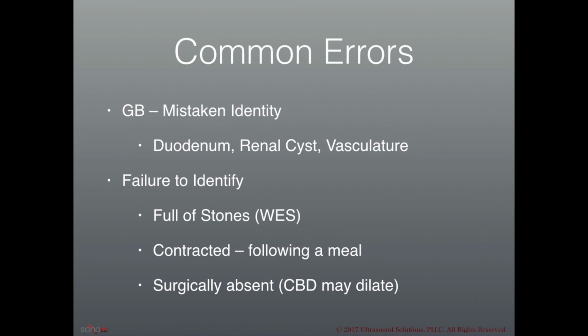You also may be unable to identify the gallbladder if it's full of stones, so we talked about the WES sign, if it's very small and contracted, such as following a meal, or of course if it's surgically absent. Recall that if the patient has had a cholecystectomy, the common bile duct will often dilate physiologically in response to that.